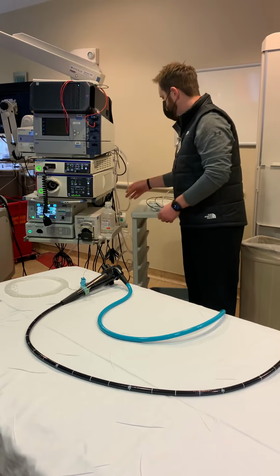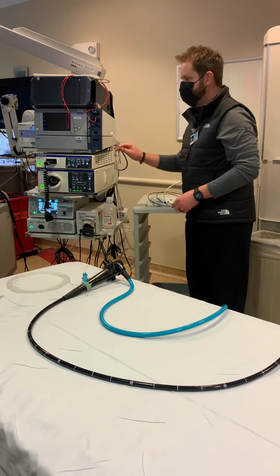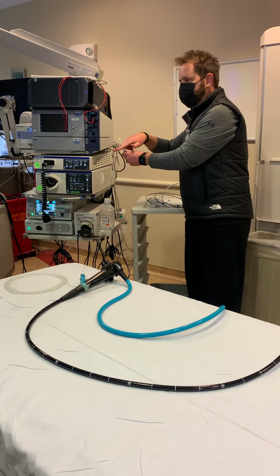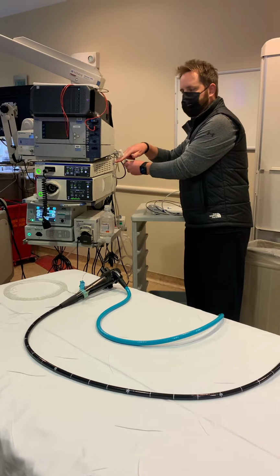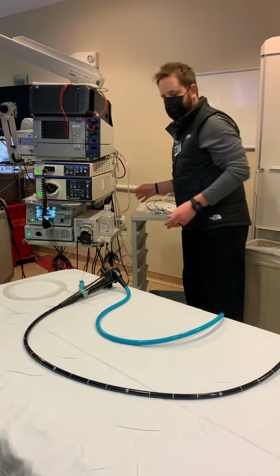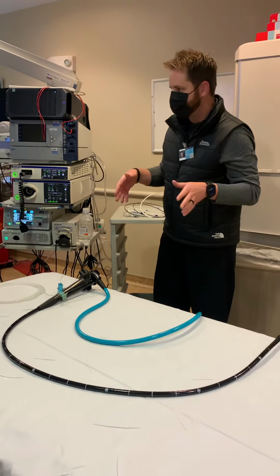And then the last step is suction tubing. There's scissors right here. We're going to cut the white tip off of the suction tubing, and that's going to act as suction for Spyglass. Okay? So that's what I would call the first person's job.